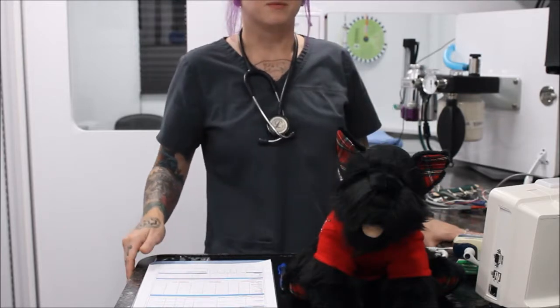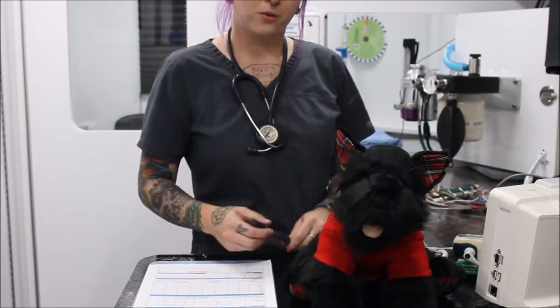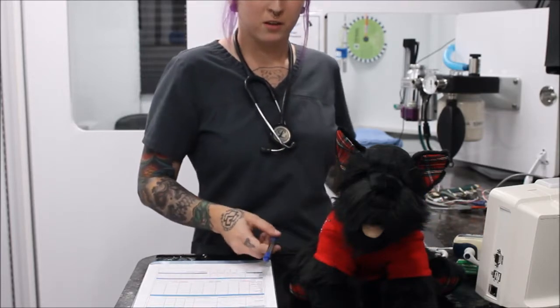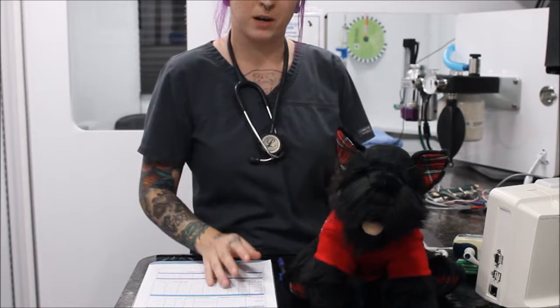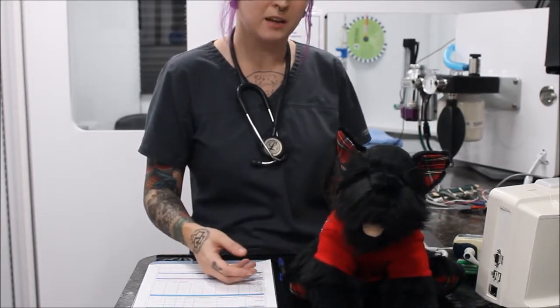Pale can indicate some kind of anemia. It can also indicate shock. So if we notice that, we want to tell our doctor immediately. Another one we don't want to see is bright red gums. Bright red gums usually can mean that they could be septic or overheating.